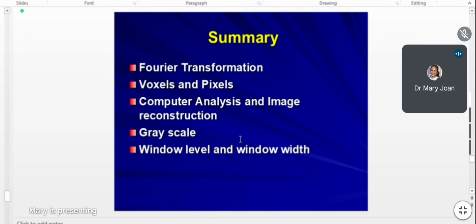As the result of resonance, the net magnetization vector is in phase in the transverse plane. As the NMV precesses at the Larmor frequency in the transverse plane, voltage is induced in the coil. That voltage constitutes the MR signal. The frequency of the signal is the same as the Larmor frequency of that magnet.